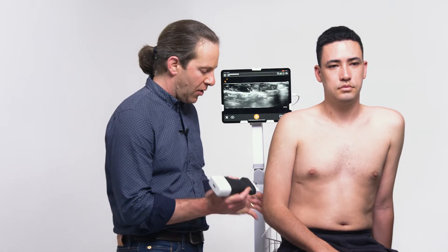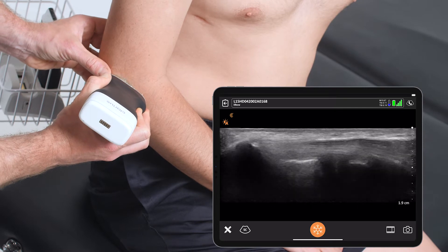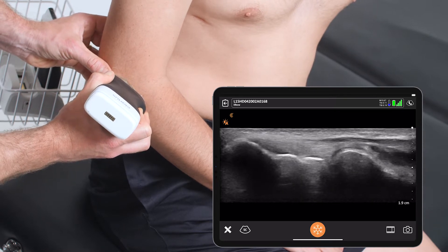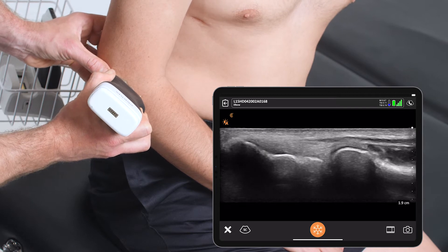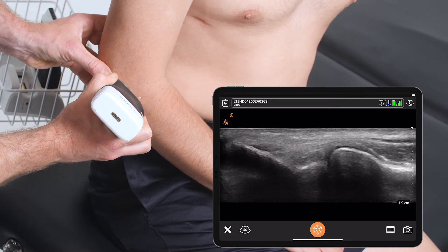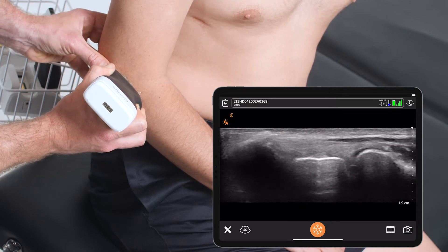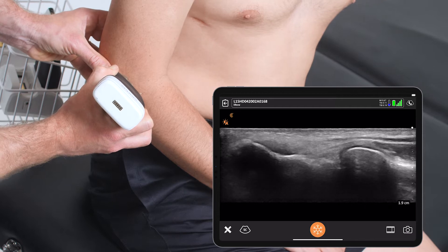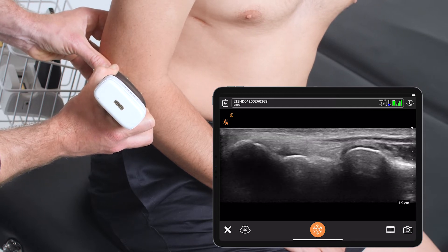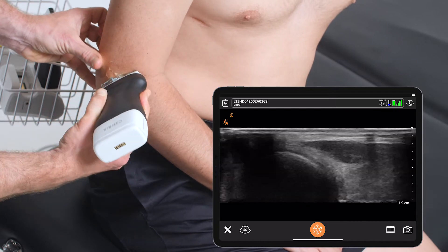I like to start my scan on the lateral epicondyle, first looking for a joint effusion that would be identified as black fluid coming out in the joint space, and looking also at the common extensor tendon that comes and inserts here on the humeral epicondyle. I'm looking for any signs of disruption, calcification, fluid around the tendon, or I could put on power Doppler to look for increased signal suggestive of tendinosis.